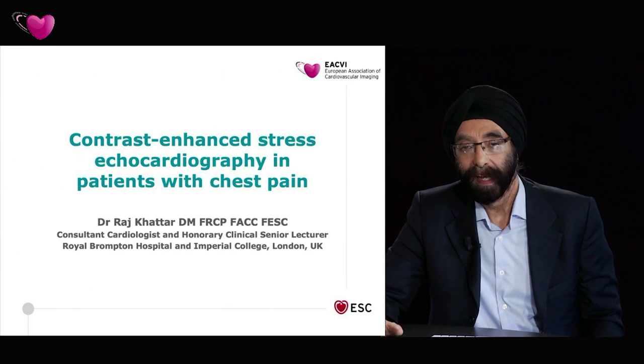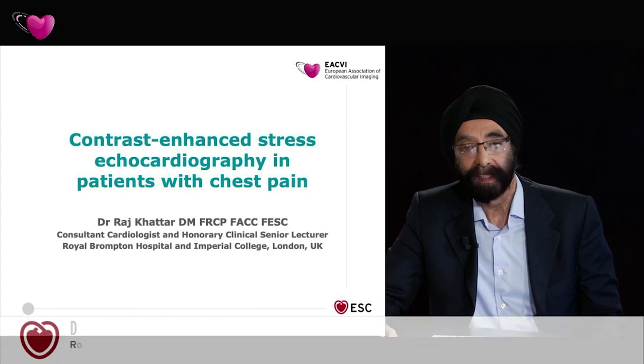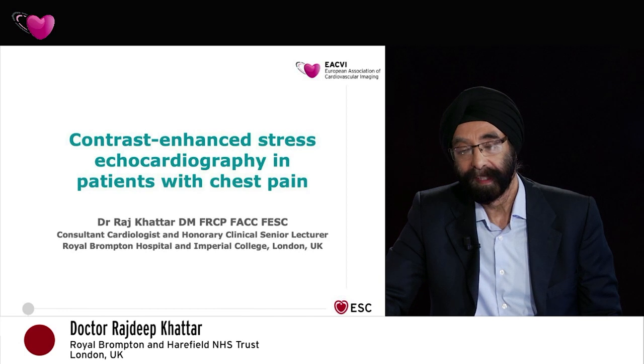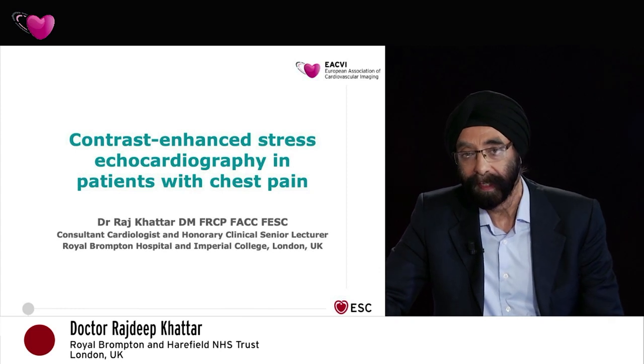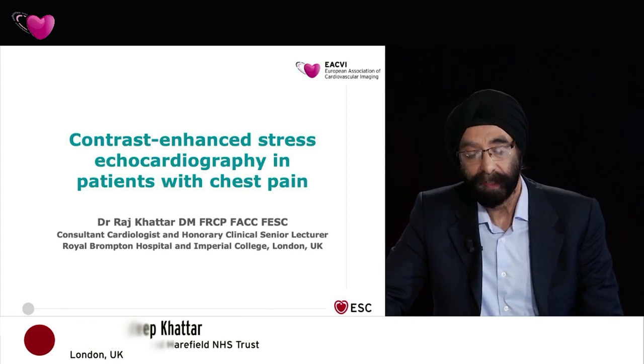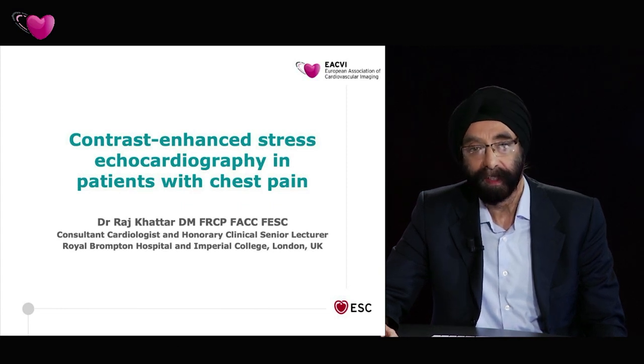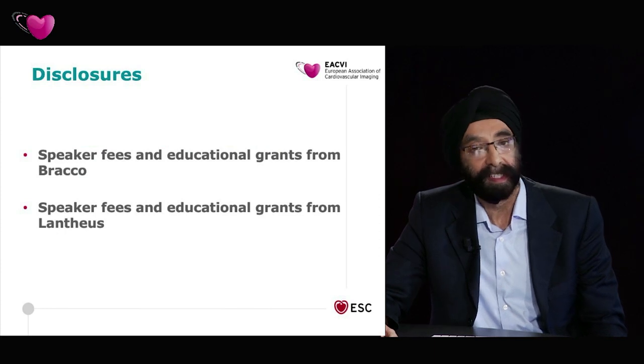So in our lab, we do a lot of treadmill exercise echocardiography. For any patient who can exercise, our preference is treadmill exercise. I would say that's approximately 75% of patients. And for pharmacological testing, we use all sorts, but predominantly dobutamine. So I'm going to show you two cases where we've used treadmill exercise echocardiography. Two clinical cases which I hope are of interest.